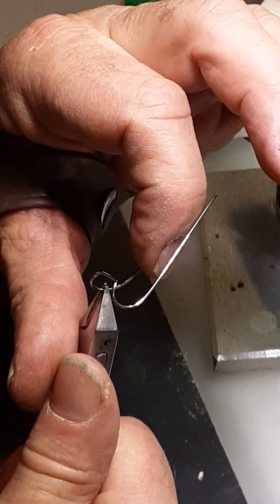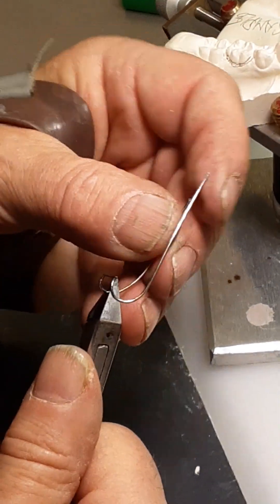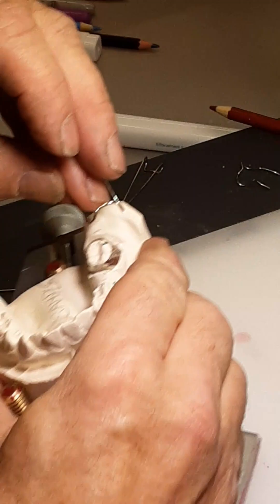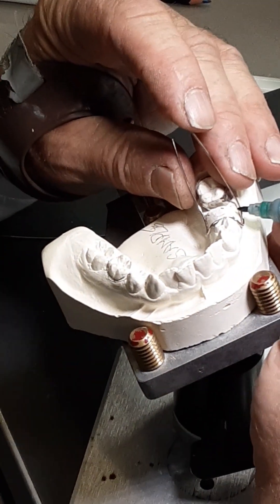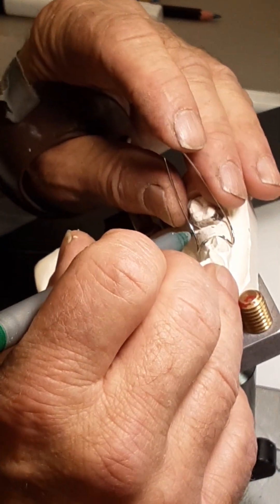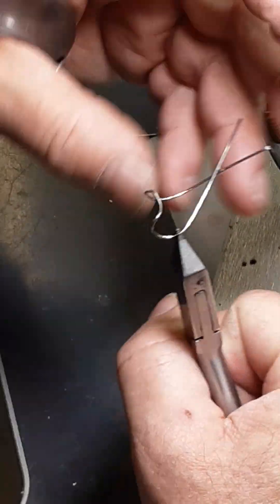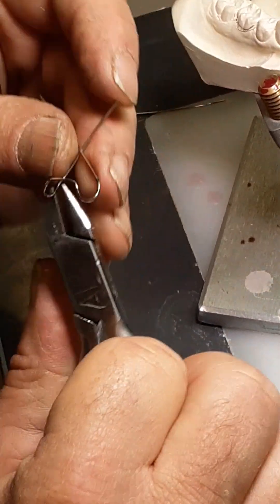I'm going to bend it in a little bit at this point and bend it out a little bit at that point so it follows the contour of the tissue better. This is going to be different for every model, every patient, and different bands on the same model — each one will be just a little bit different. These are all very very small adjustments. Where it's coming up to the mesial of the band I want it to follow the contour of the tissue, so I'll bend it in a little here, a little there, and up close to the tooth I'll curve it in so it follows the tissue and then goes towards the tooth.